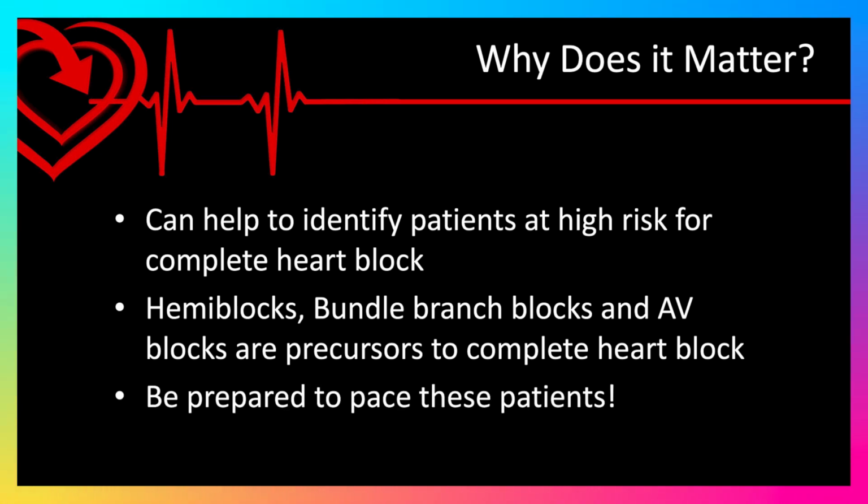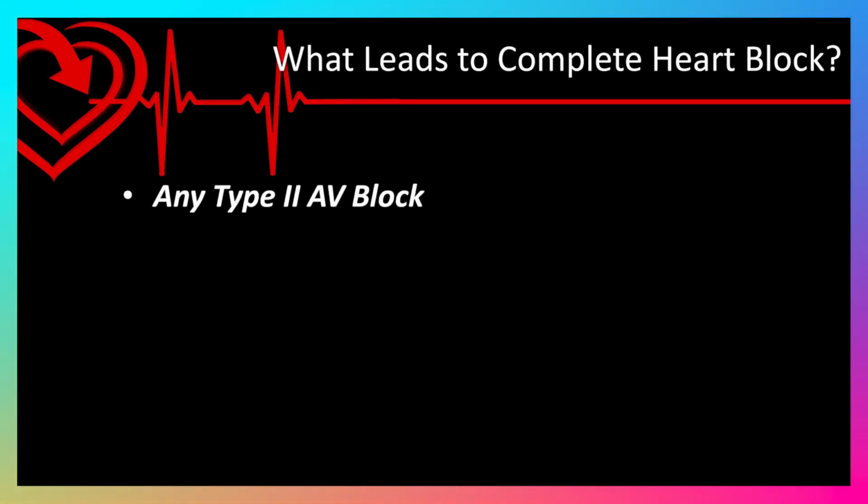We need to be ready to pace these patients. So if we pick up on these clues early, we can be ahead of the curve in terms of recognizing which patients might develop a complete heart block and which patients might need a pacemaker. So what leads to a complete heart block?